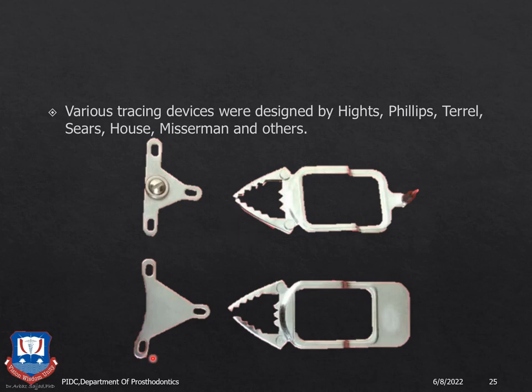So these are the central bearing plate with the plunger, central bearing plates which are attached first to the... this is the type of the intraoral tracer, and this on the right side is what we see, the extraoral tracers, extraoral Gothic arch tracers.